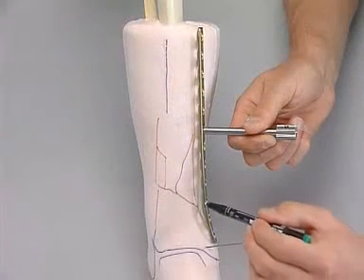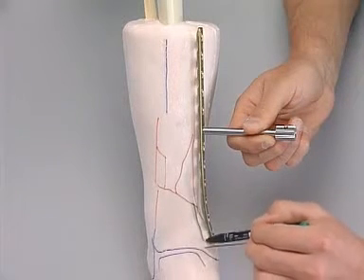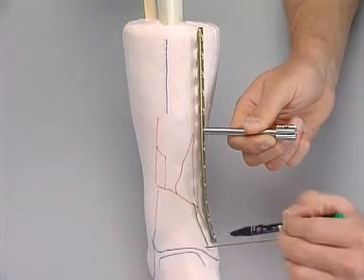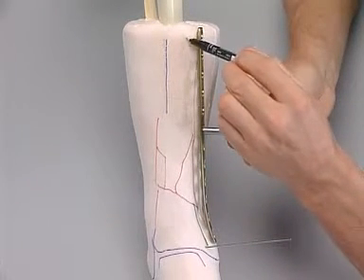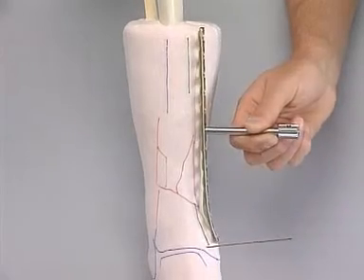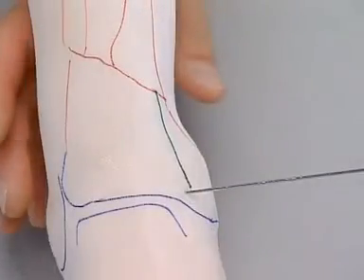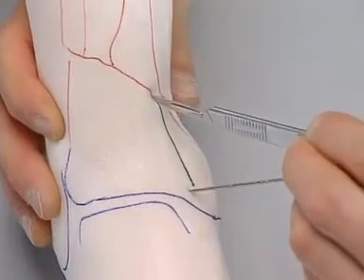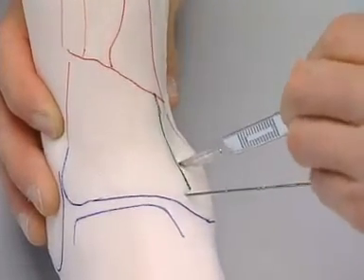At the proximal and distal ends of the plate, the planned incisions are marked in over about 3 of the plate holes. Using the marking as a guide, the soft tissue is incised. The periosteum is not opened.